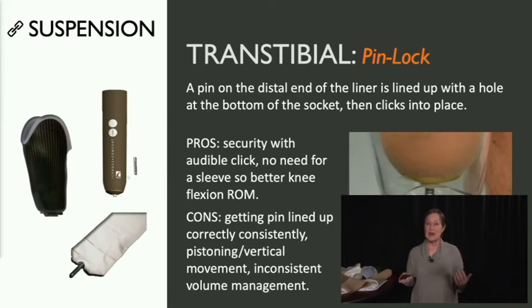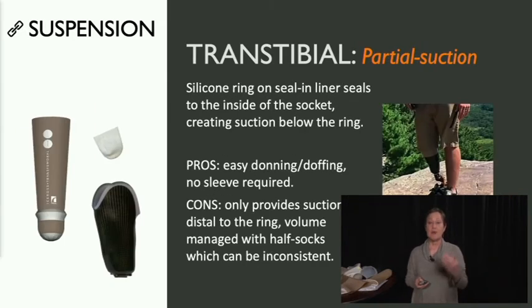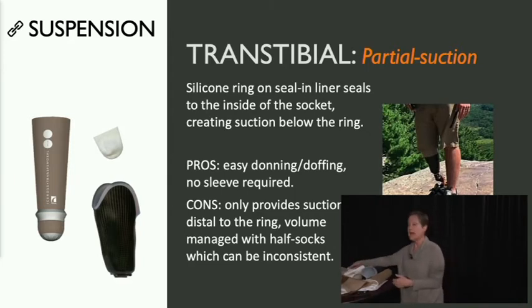An example, I had a patient some years ago with pretty significant diabetic neuropathy in his hands. So a lot of muscle wasting in the lumbricals. And he had a lot of difficulty managing sleeves. So I had to go back to the prosthetist and talk about other options for him. Okay, partial suction. You may see this occasionally. Again, talk to the prosthetist to see what they like.